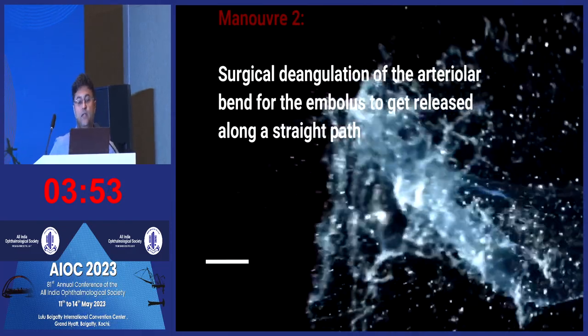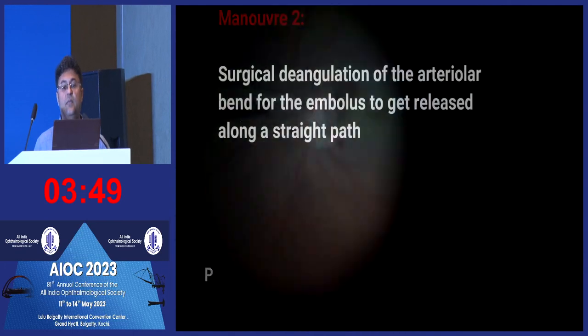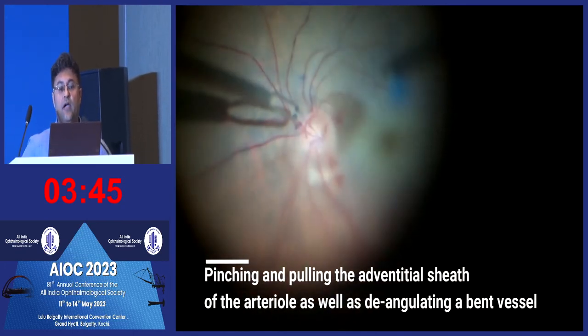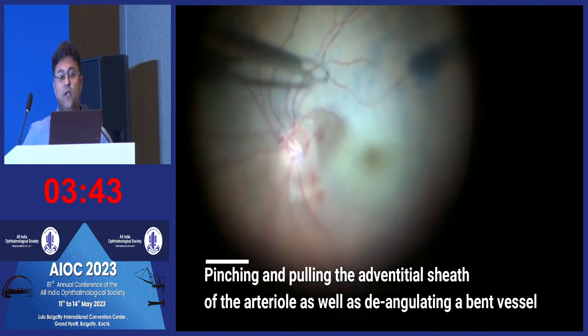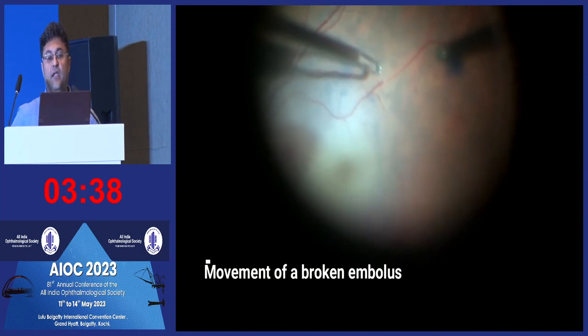The second maneuver that we do is straighten the artery. We lift or nudge the artery such that it becomes deangulated. If you see here, you see the movement of the embolus along the artery. And as you see the movement of the embolus, the good part is that you see the circulation coming in right behind, right through.